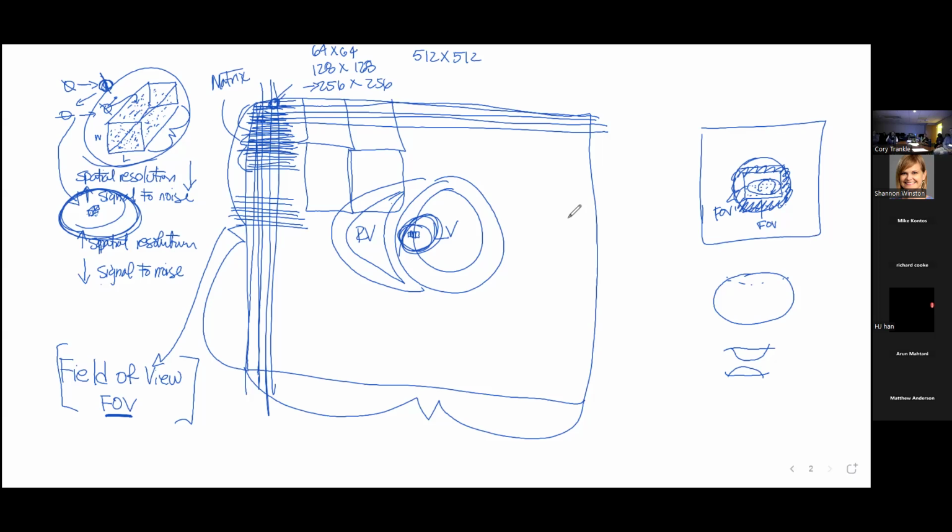When you're doing an 18-year-old with transposition or whatever, you're not trying to figure out, is there prior MI or is there something going on in the LV? You don't need that. You want to get them in and out and go quicker. 1.5 is much better for that. Okay, so there's different field strengths, and that really is affecting some of that T1 stuff.